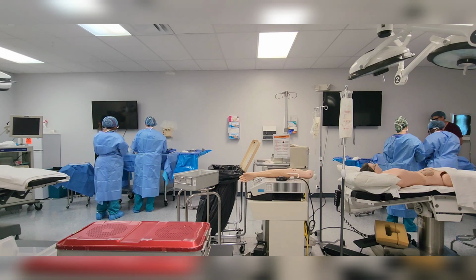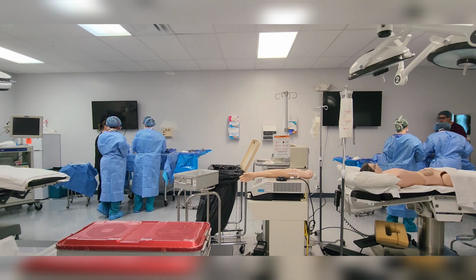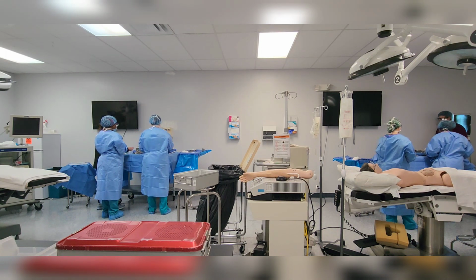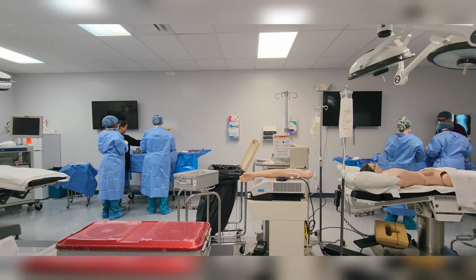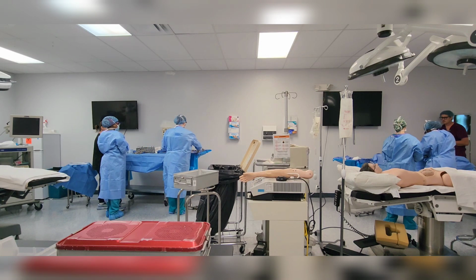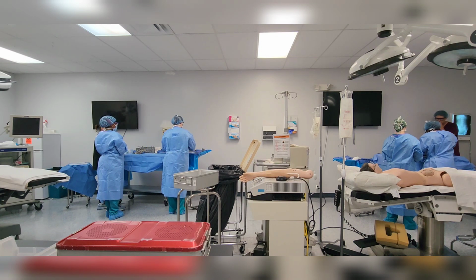Do you leave it on the back table? Yeah, I just leave it on the back table. That way we don't use it until the surgeon's ready. Otherwise, you're going to have to try to organize it later. So what you're probably going to want is a couple of DeBakeys over there, because when you make your incision, the surgeon might want DeBakeys after that. So there you go.